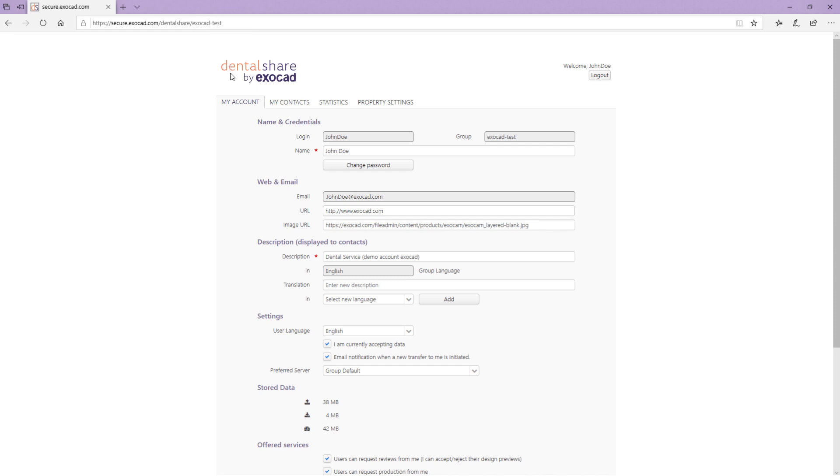The DentalShare user account consists of four tabs: My Account, My Contacts, Statistics and Property Settings.